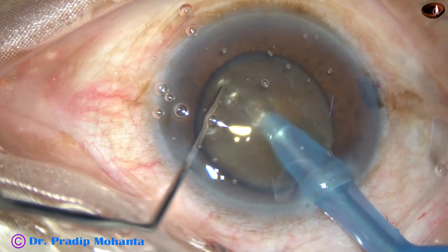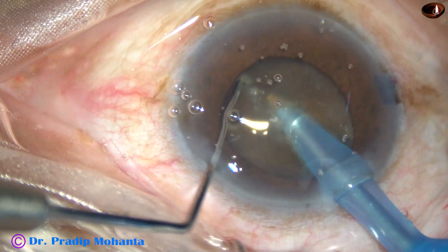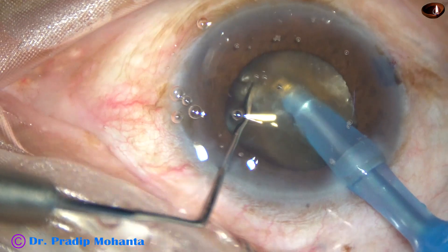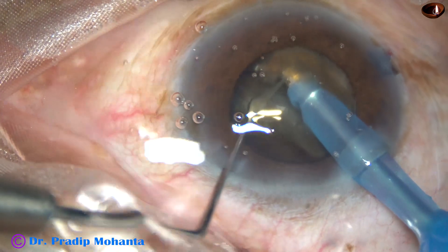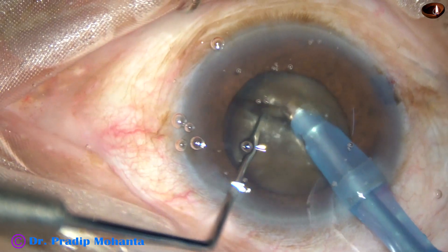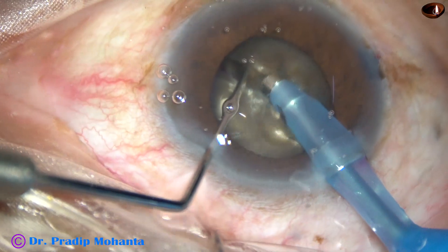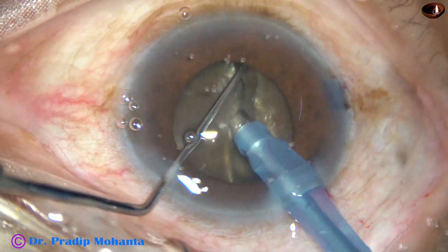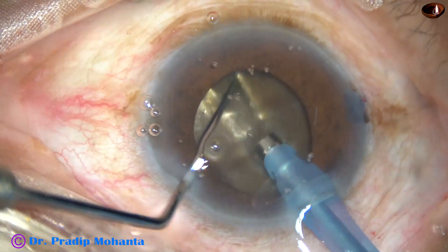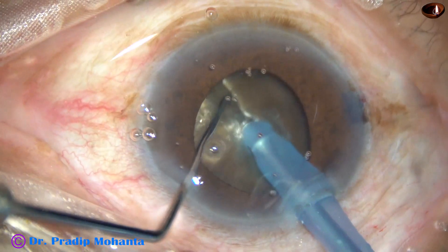The nucleus is divided into two heminuclei. This is the first crack. Lateral separation should be very gentle, equal on both halves. Rotate 180 degrees. Make two or three grooves to go to a deeper level.